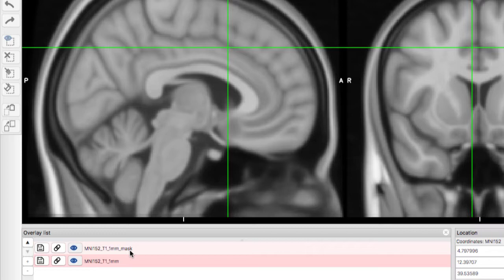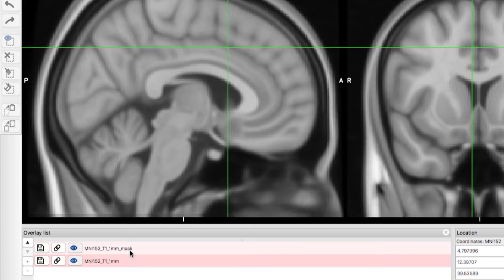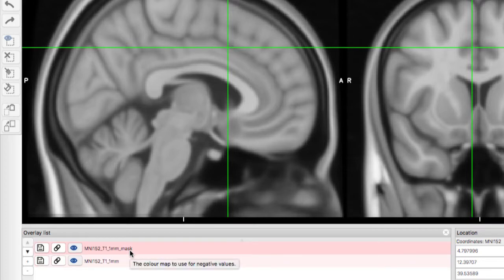If your data was warped to another template, you will either have to create the mask using a copy of that template or resample your mask to the data. Also make sure to highlight the mask so that any changes affect the mask and not the original data set.